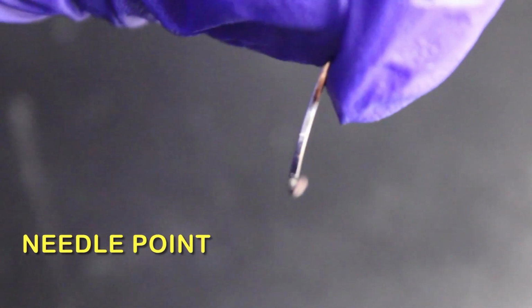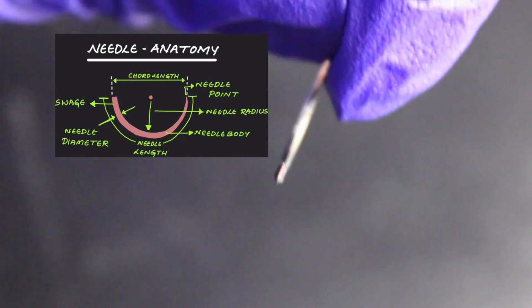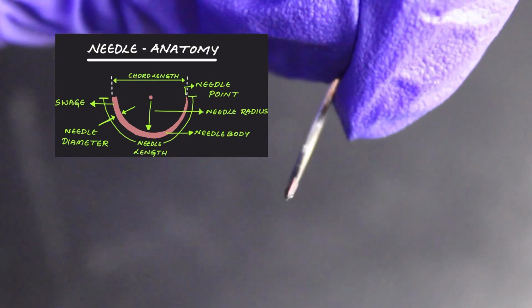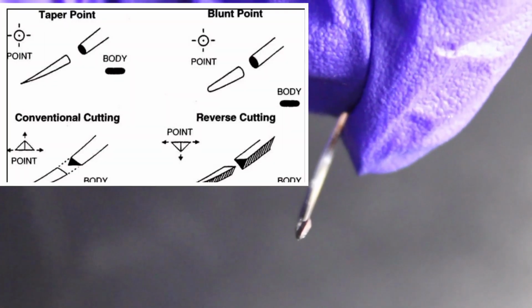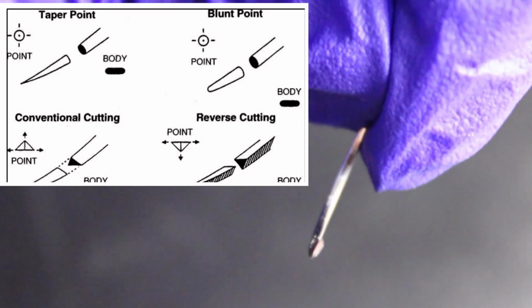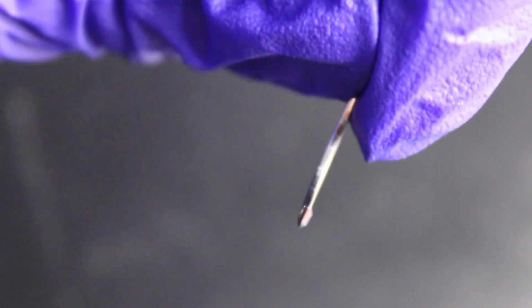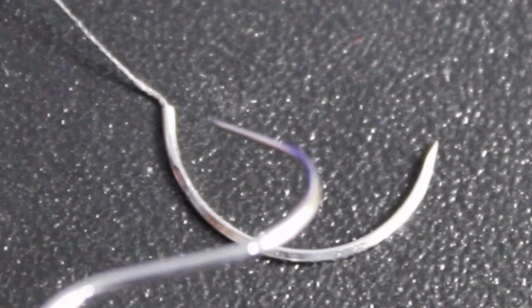Finally, we get to the needle point. This is the tip that penetrates the tissue and it runs from the tip to the maximum cross-sectional area of the body. Just like the body, the needle point comes in different shapes. It can be conventional cutting, reverse cutting, side cutting, taper cut, taper, or blunt. So choosing the right tip is essential for controlling trauma and ensuring precision in suturing.